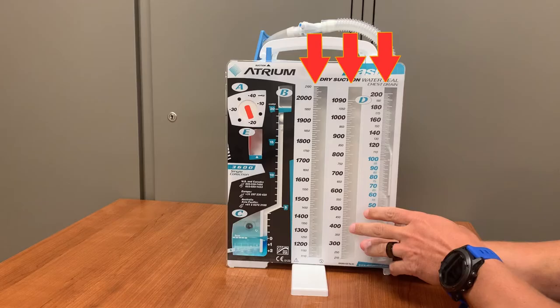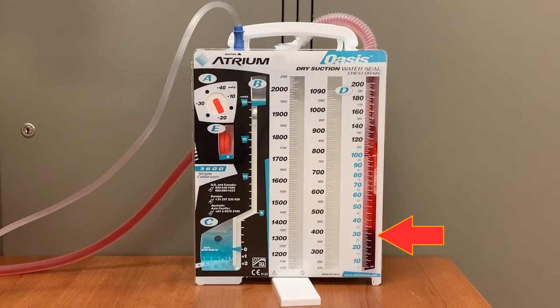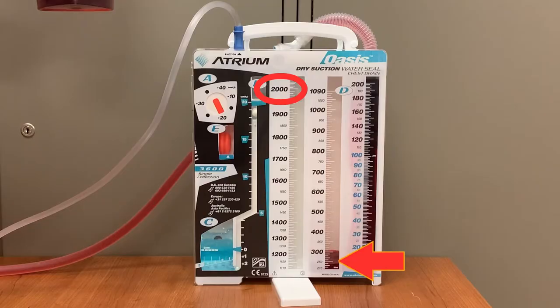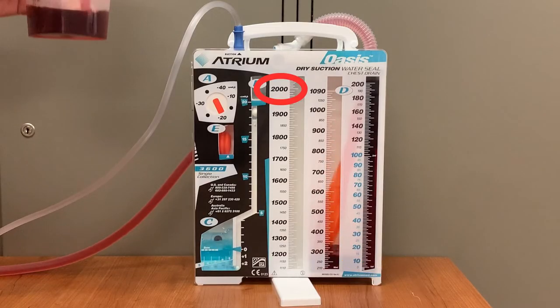The three columns on the right, labeled D, are where suctioned fluids will be stored and measured. Fluid will first fill the far right column to capacity, then the center, and finally the leftmost column to a total of 2 liters. Measurement markings on the columns allow for easy measurement and documentation of output volumes.